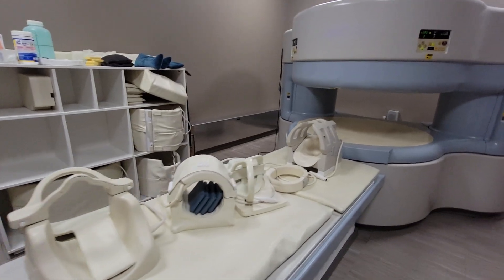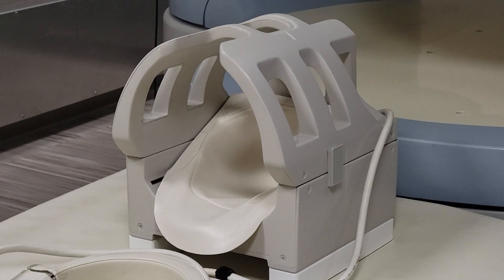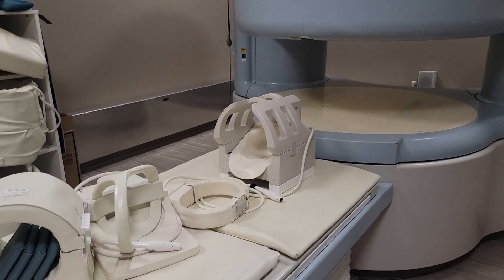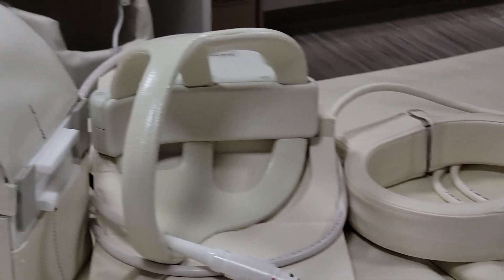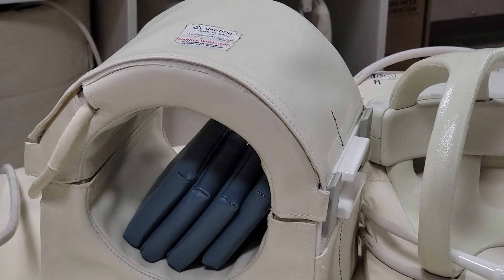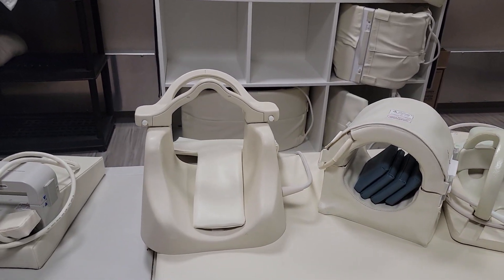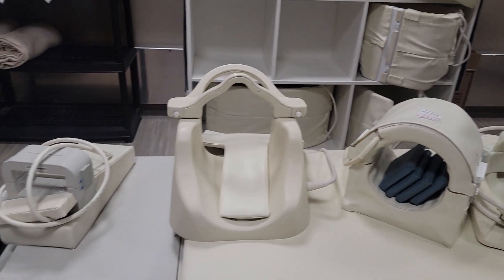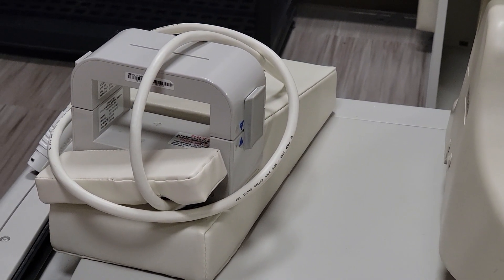So we're gonna start off with our head coil — that's what that is over there. Next is our shoulder coil, which is that one and that one. Next is our knee coil, and next is our c-spine coil, and last but not least our wrist coil.